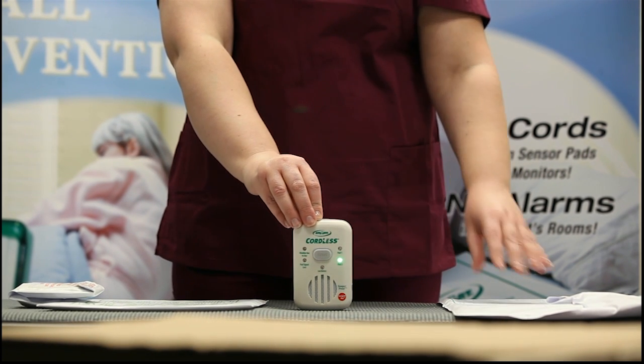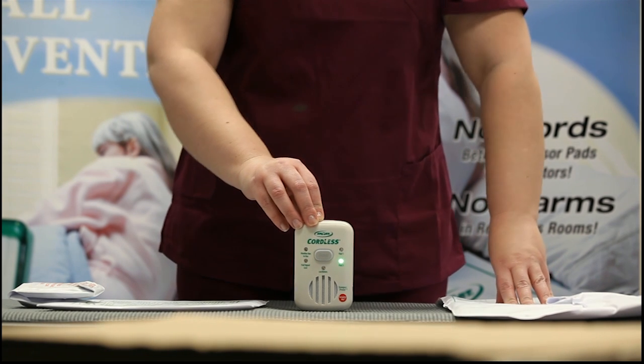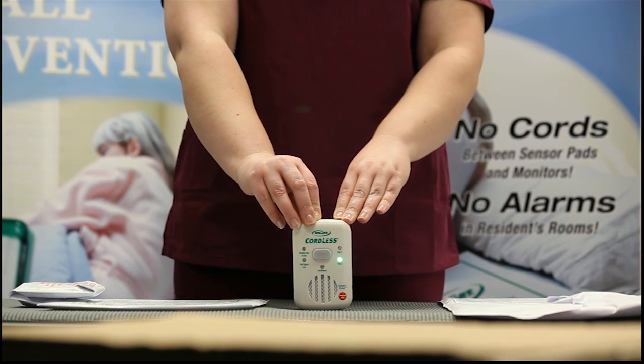Press on the second pad and release. If you have a floor mat, turn the transmitter on. The monitor will beep twice and the light will turn off.